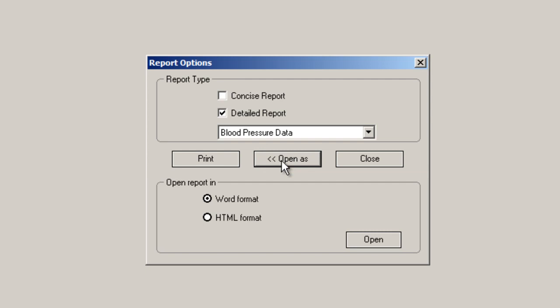You can click on Open As and choose Word Format for Microsoft Word Compatible files, or HTML Format, which works with most browsers. Select Open and you will be prompted for a file name for the report.